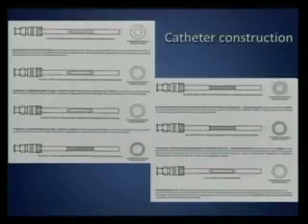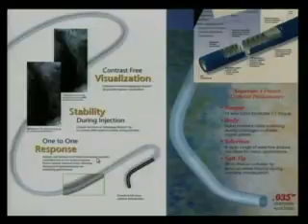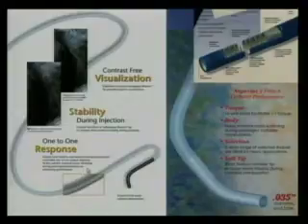You can have different shapes of catheters, okay? So what does a catheter have? You need it to torque. If you have braiding, this is the braiding, you can torque the catheter and move it around. Body, is it made of nylon or what? So it is material resist softening. Selection, so you have different catheters for different shapes, and then a soft tip or what type of catheter tip is there. So this is the tip, this is the material, this is the shape, and this is the braiding. Depending on these, you can have different catheters.